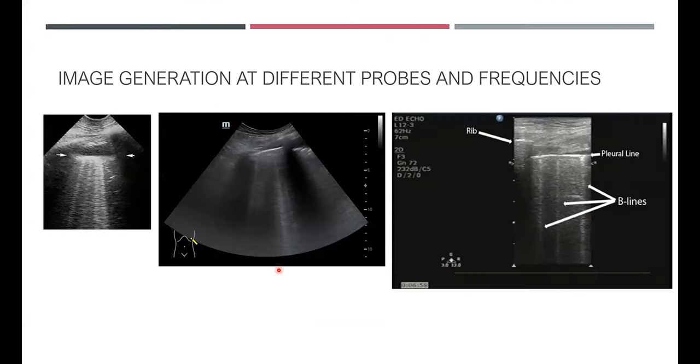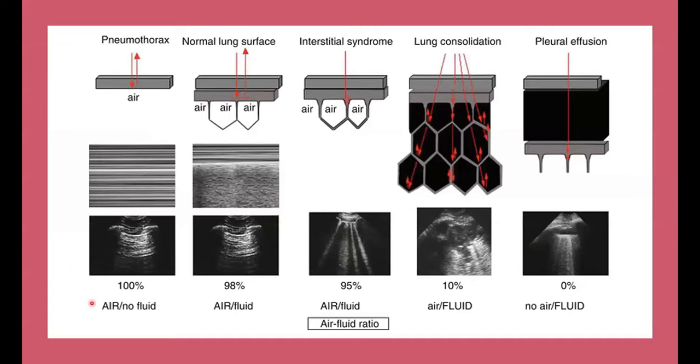And for me, the important aspect when you're describing your lung ultrasound is that there's a learning curve. But if you can show me the batwing appearance, pleural sliding, and interpret what you think of the lung in terms of visible A and B lines, that's all I want to see in the next 2 weeks. I am quite happy for you to learn profiles as time passes by. If we can just describe what the normal batwing sign looks like in a normal lung, what A lines and B lines look like, and your interpretation of what kind of B lines you see in the context of the probes that you're using, we're looking at pattern recognition at this particular stage. Once we're able to do that, then we're looking at normalcy versus pathology, depending on the clinical course and history the baby is showing us.